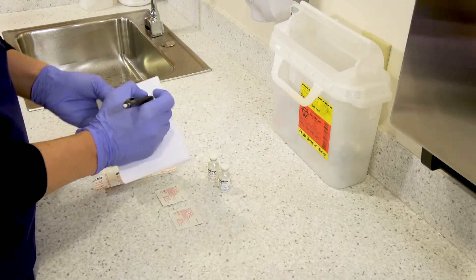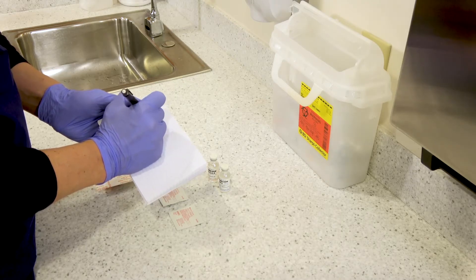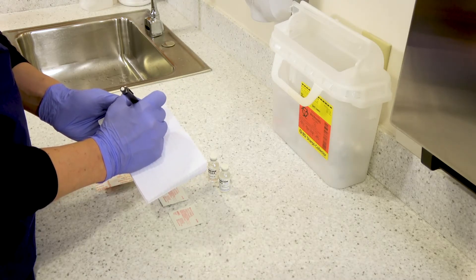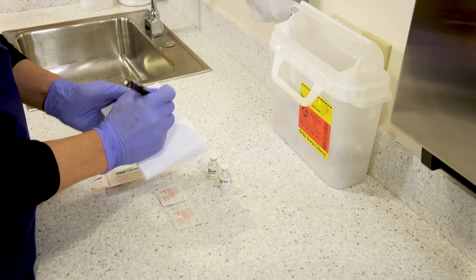So first step of course is to calculate the total required volume of medication needed. In this case we're going to use an example order of 10 units of NPH and 5 units of regular insulin. So that's 15 units total.